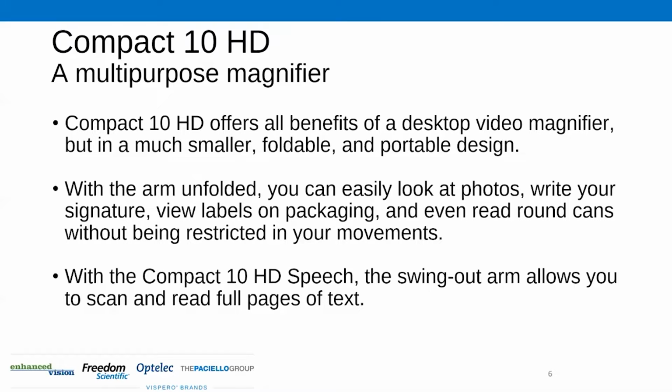And that's just not how we live our day, how we live in modern day society. So it's far more efficient for you to bring your video magnifier to the places where you need access to print. So you could go from a living room, a dining room, to the kitchen, and from reading a book to reading a recipe, or reading your mail to reading a recipe. You could hold that thing up and make sure your thermostat settings are correct on your house system.